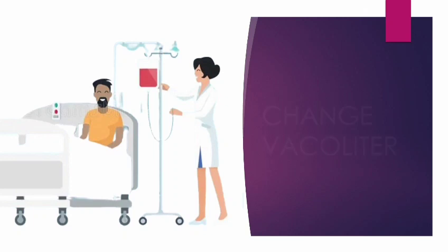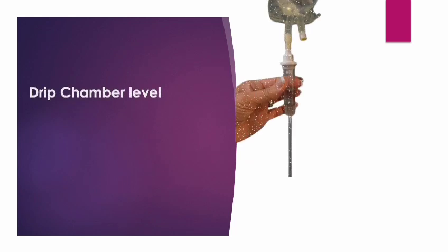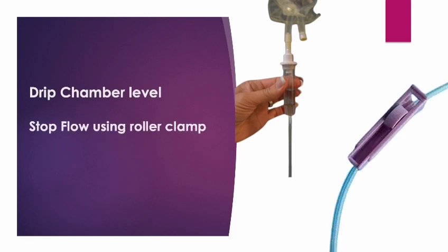For continuation of therapy, please change the solution when the vacolitre or the bottle is empty or when a new vacolitre is prescribed in the prescription form. To enable proper priming of the line, make sure that the drip chamber is half full. At the same time, use the roller clamp to stop the flow of the drip. This is to prevent wetting the linen.